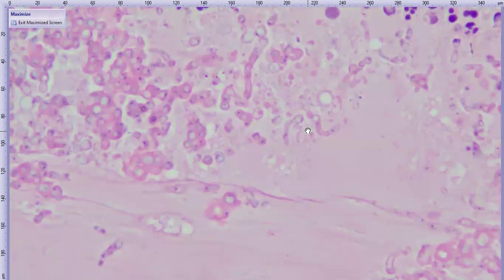Most likely this was originally gastrointestinal candida that disseminated systemically. Candida is a regular organism in the gastrointestinal flora of our patients. So it's sort of expected to be there, but there are conditions where it can overgrow. Presumably, the immunosuppression in this patient contributed to this to some extent. Being on steroids and mycophenolate was probably part of why the candida disseminated the way it did and overgrew in the GI tract. It's unclear exactly what the steps of pathogenesis were in terms of how this case progressed.